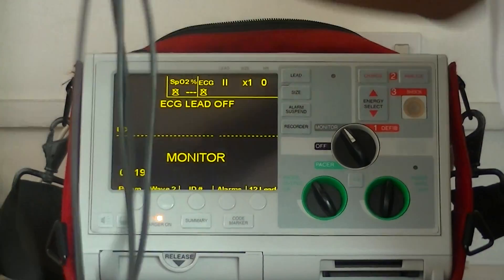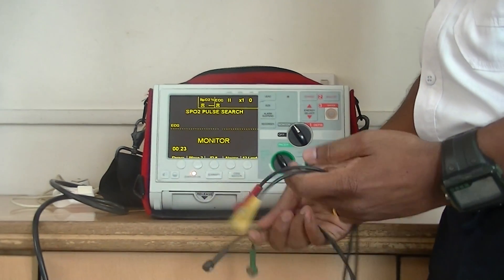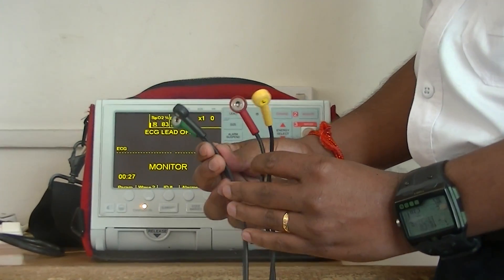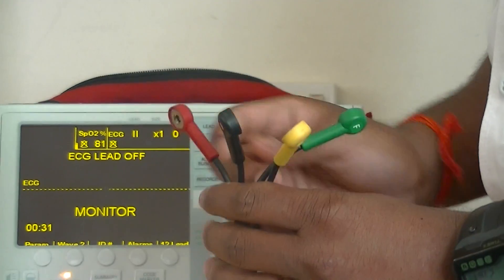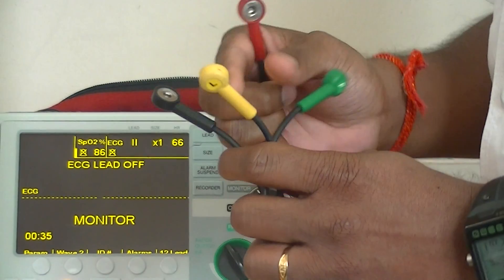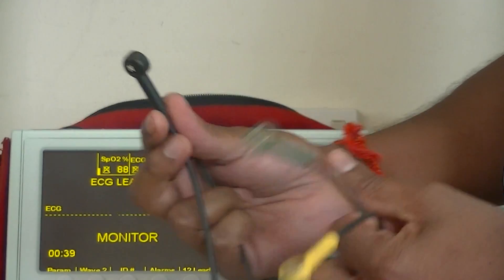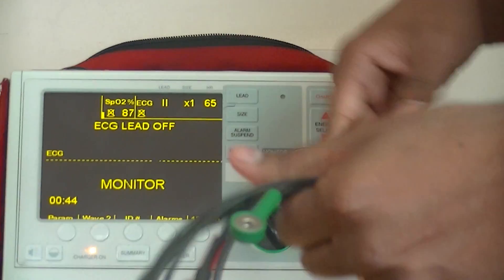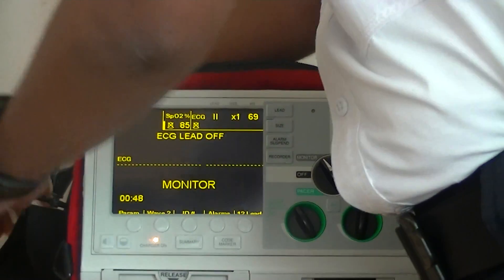With this, we get the cables where you have 4 ECG connections: red, black, yellow, and green. You can attach these to the patient — red on your right side, yellow on your left shoulder, green on your left bottom, and black on your right bottom. Once you attach this, you can see the ECG will be analyzed.